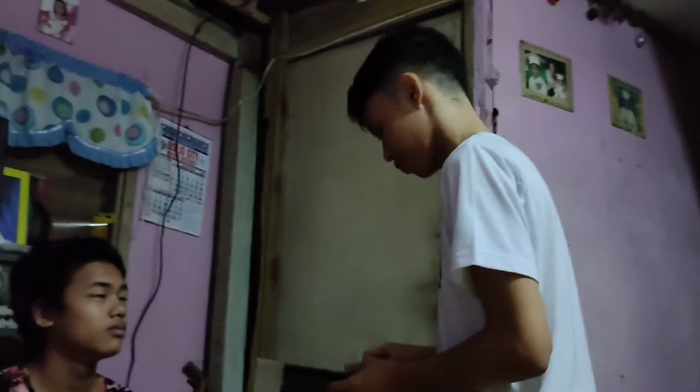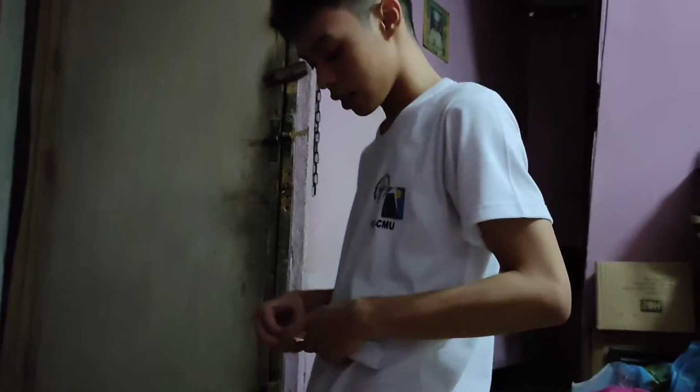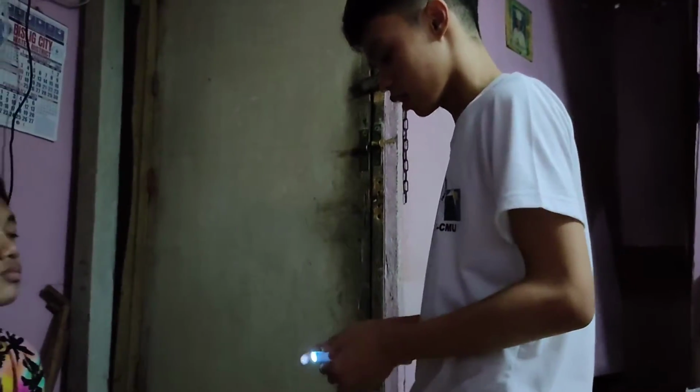Then moving on to the nose. You're going to inspect the patient's nose for symmetry, size, and shape. Okay, sir, I want you to stay still. We will look at your nose. Okay. Then I want you to tilt your head back, sir, so that we can check your nasal mucosa. Here we have an improvised pen light to check the patient's nasal mucosa. Let's tilt your head back, sir. Okay, sir, look up.